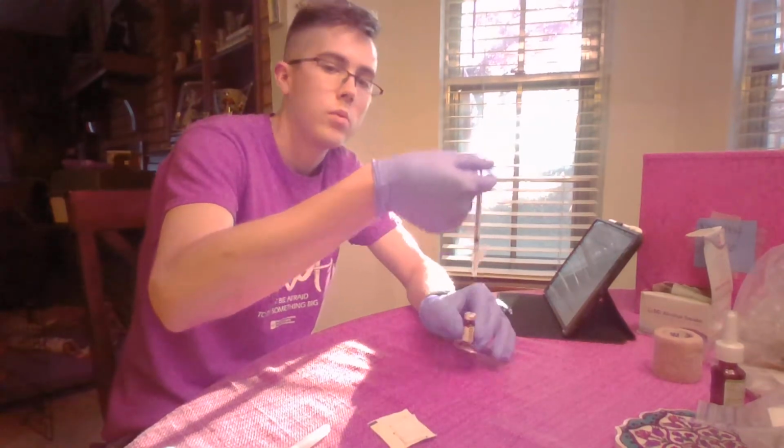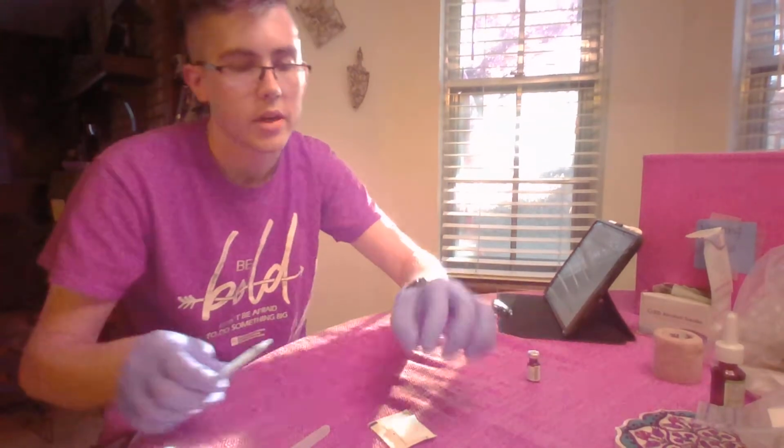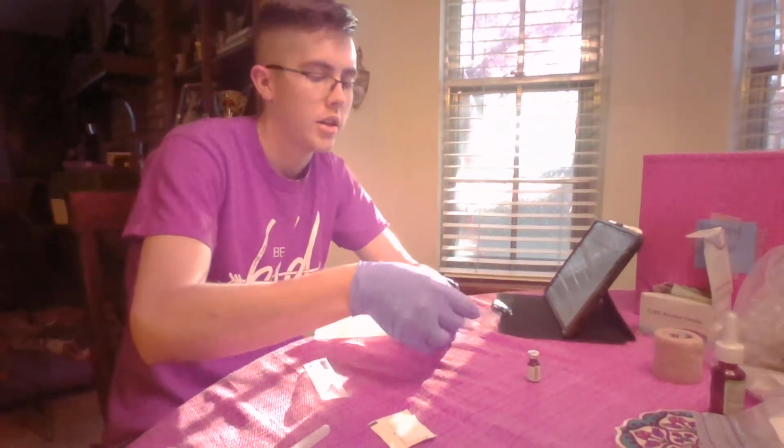Attempt number 2. Okay. And then we do it all again.